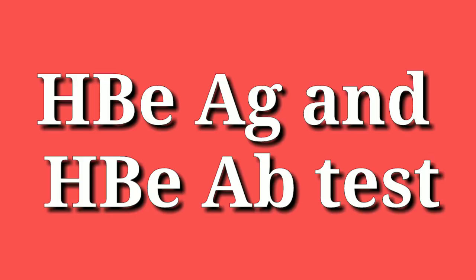So what do the HBeAg and HBeAb tests mean? It is actually a diagnostic test performed by ELISA, in which we find out the antigen of the hepatitis B virus and the antibody that is developed against the hepatitis B virus. So this is a little bit about the HBeAg and HBeAb test.